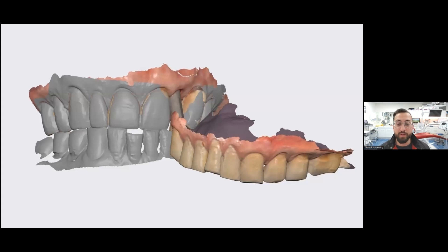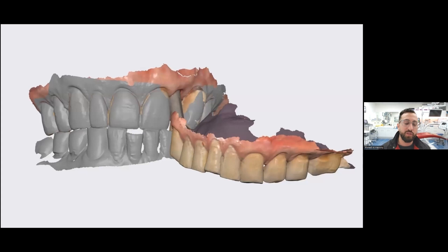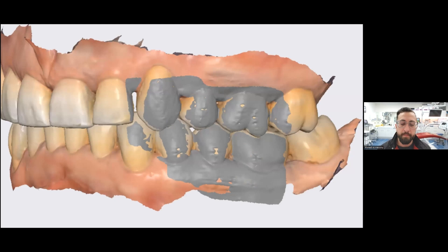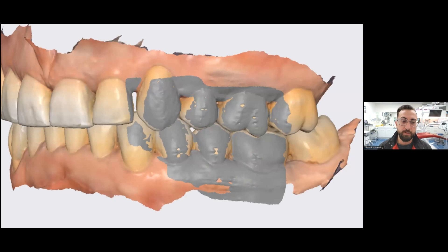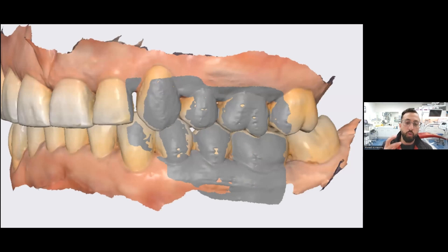This just happens sometimes where the bite scans are all wacky and weird. Sometimes this is due to the software. These days it's actually quite rare, and oftentimes when I see this happening is when there's a lot of soft tissue interference, which can really muck up a bite scan.